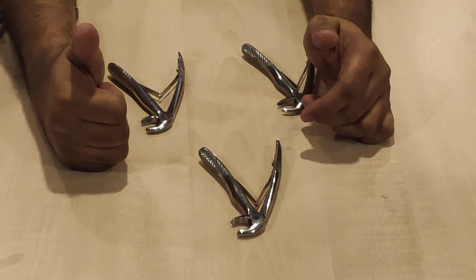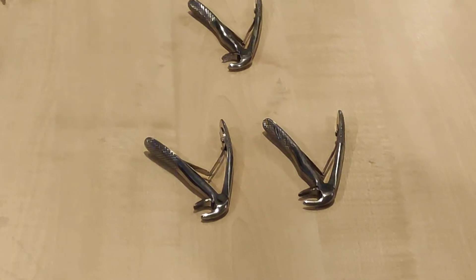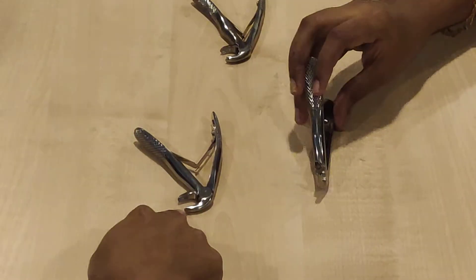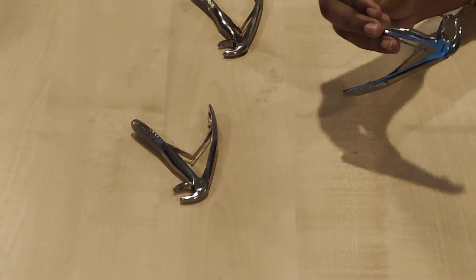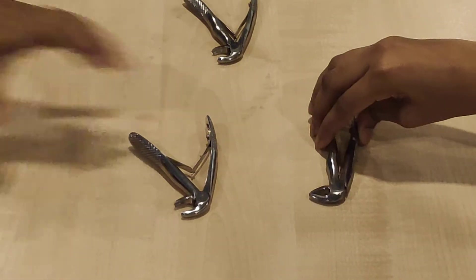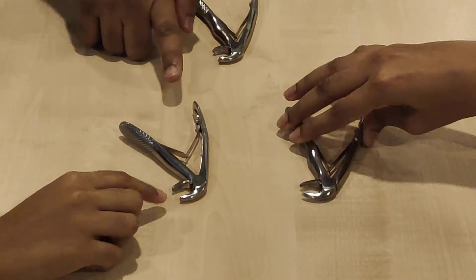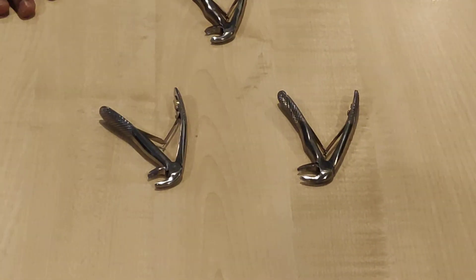That leaves us with incisors and canines. So tell me the difference between these two. We must close and check. There is a space there. So this is for canine, this is for incisors. Clear now? Okay, let's do an exercise.